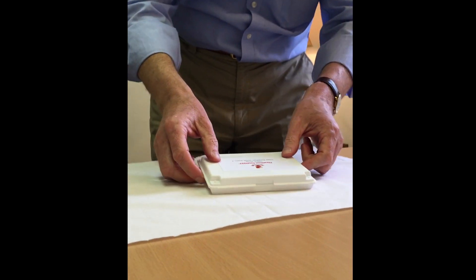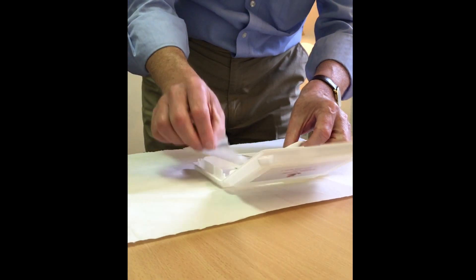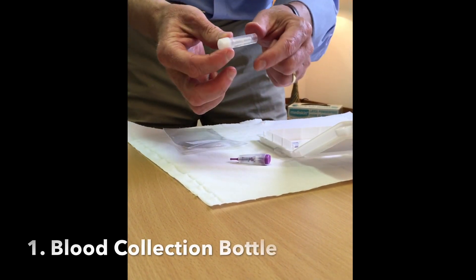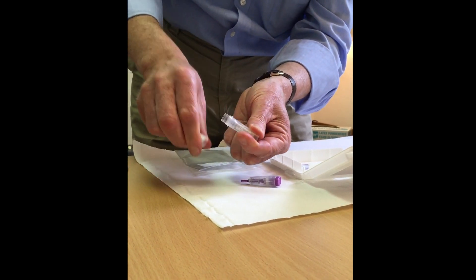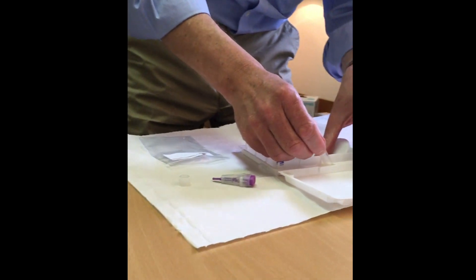This is the blood collection kit and the contents are contained in this little plastic bag — you have three parts. You have the blood collection bottle, and to prepare the bottle you screw off the cap. We're trying to bring the blood to the 200 marked line.